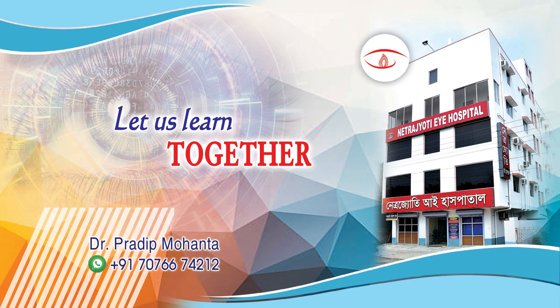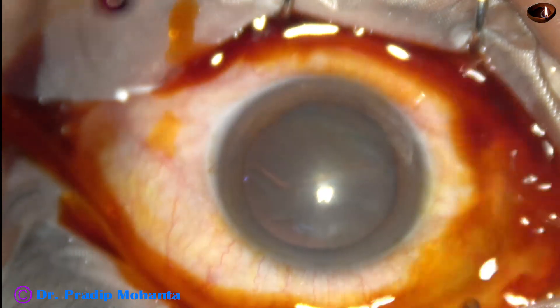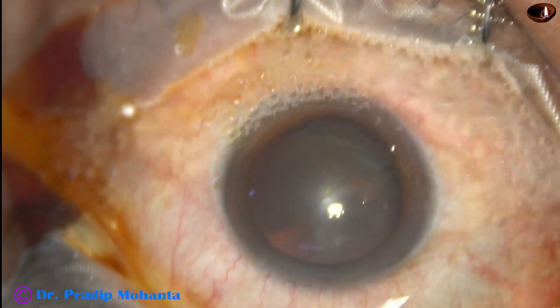Friends, welcome to my workplace for hands-on PHACO and SICS training. Let us observe the management of this soft cataract.